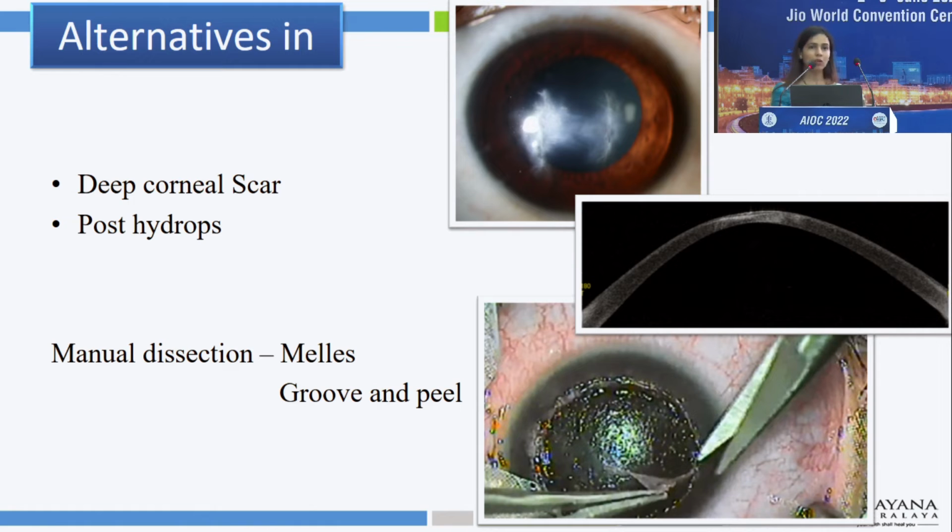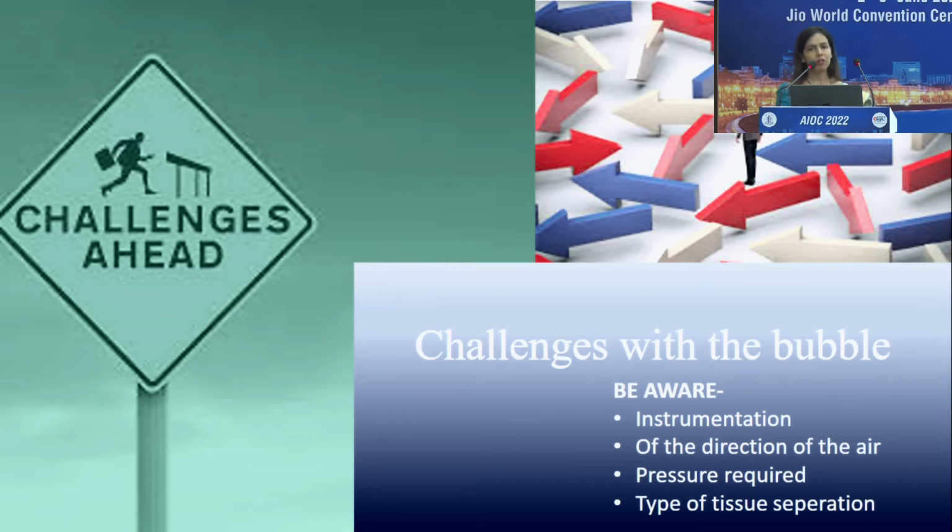Now, what are our alternatives? This will be taken in detail by our next speakers, but just because we have a deep scar does not mean that you can't go ahead with the DALK. This is still possible even in a post-hydrops scar. A lot of people are very worried about the bubble and challenges with the bubble.